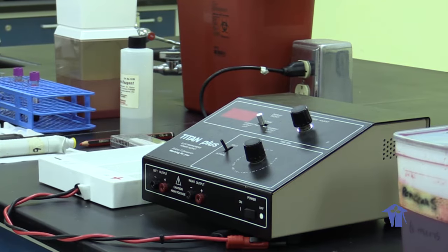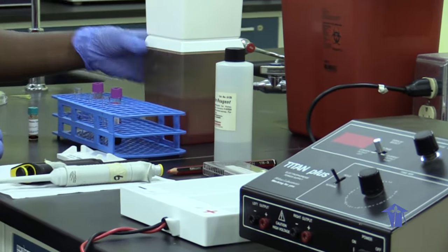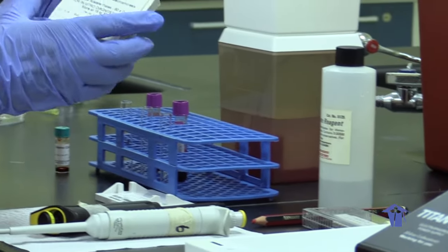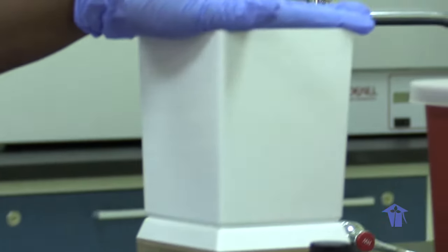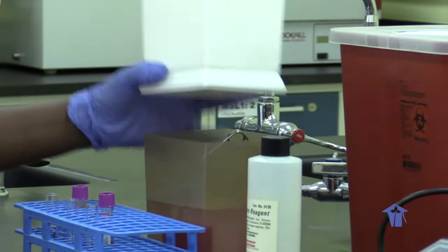Okay, so this is lab 9, as Dr. Campbell was saying. This is our hemoglobin electrophoresis setup here. We have our Titan cellulose acetate plates that we use. We soak these for a minimum of 20 minutes using the Super Heme buffer.